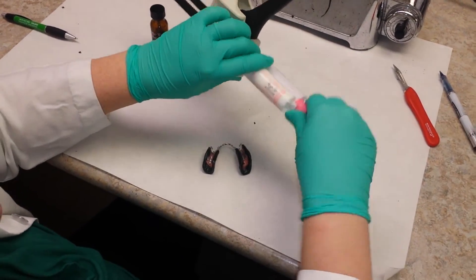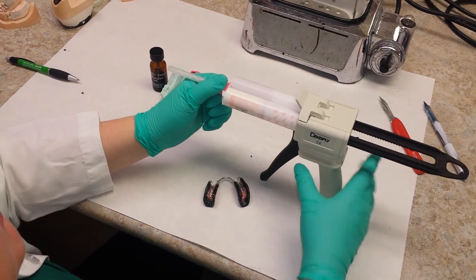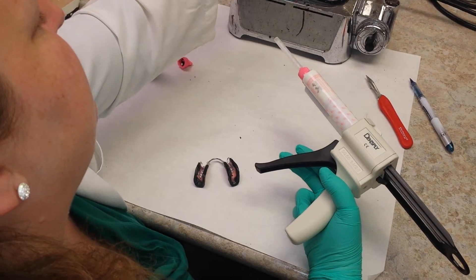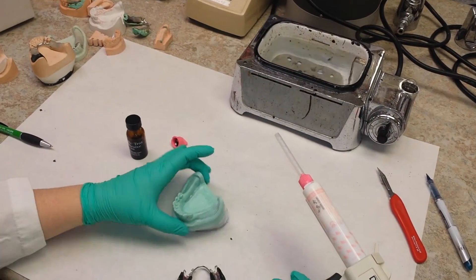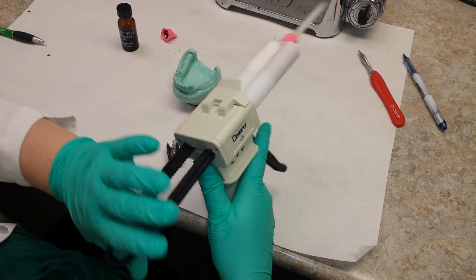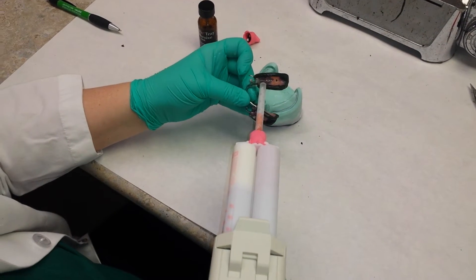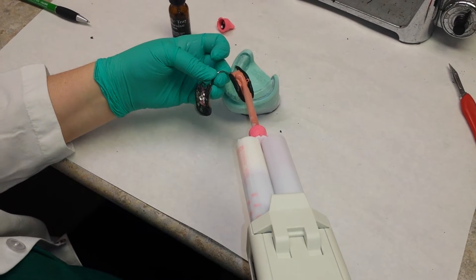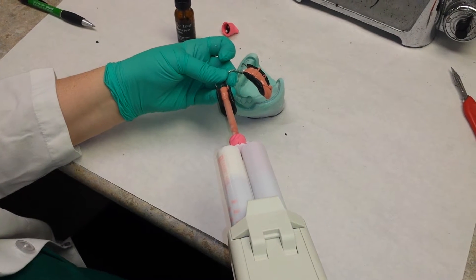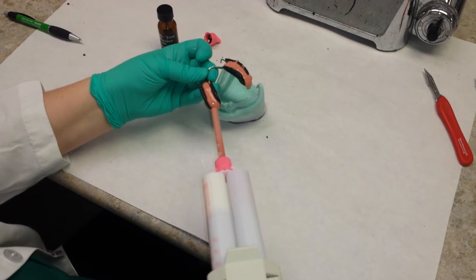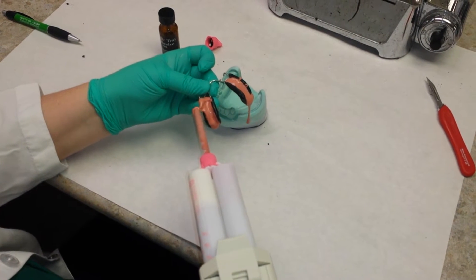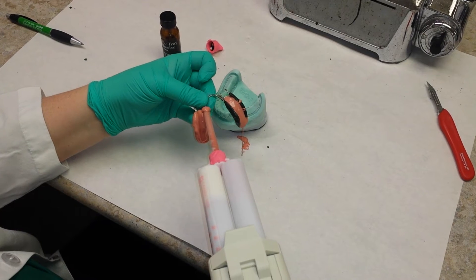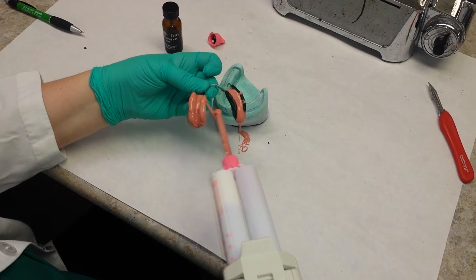I'm going to be using a light body impression material. This happens to be Examix, and then I'm going to be placing it on the cast. When you place the material into the impression, you don't want to just fill the impression tray like that like maybe you normally would. Instead, you want to actually move the impression material onto the borders. Move it out of the middle onto the borders so you have the same amount of material on the border as on the inside.